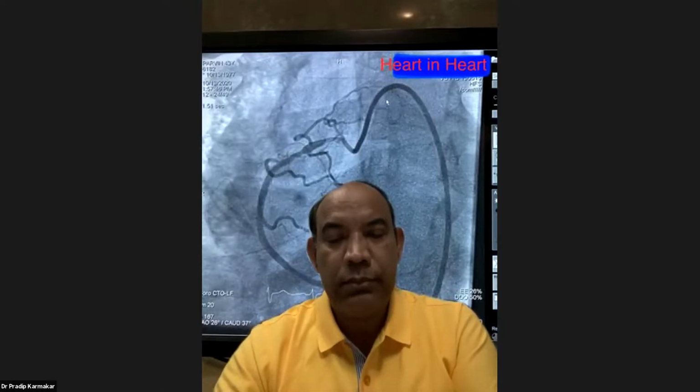Let's start from the reverse, expansion and apposition. We like both, as you mentioned. The stent should be fully expanded and well apposed to the vessel wall. What you may not achieve is expansion, like say with nodular calcium, but apposition has to be achieved.